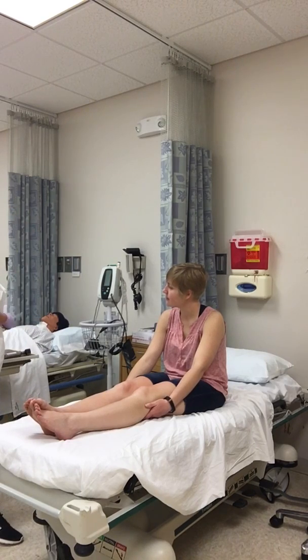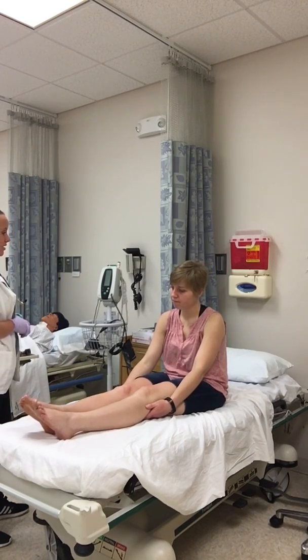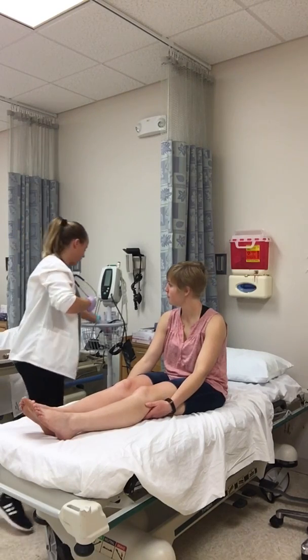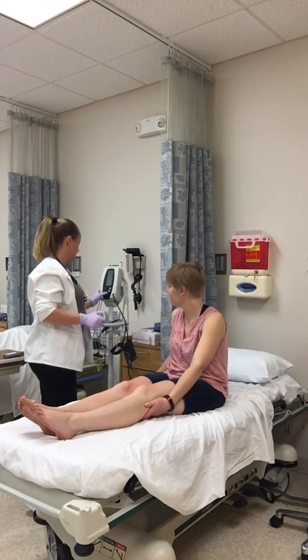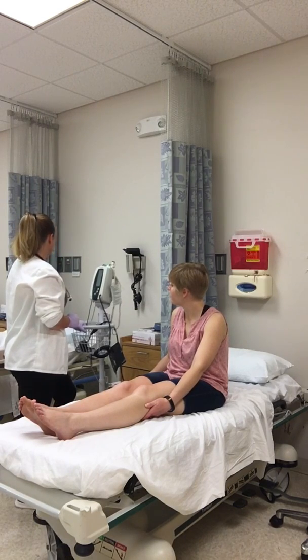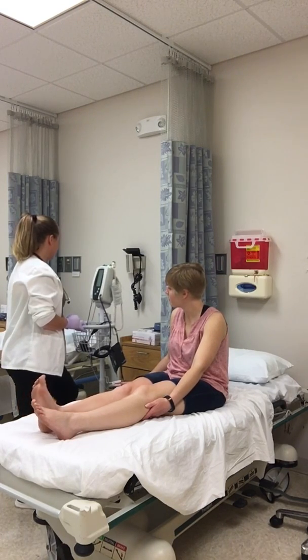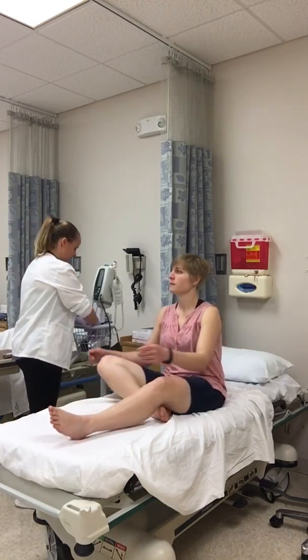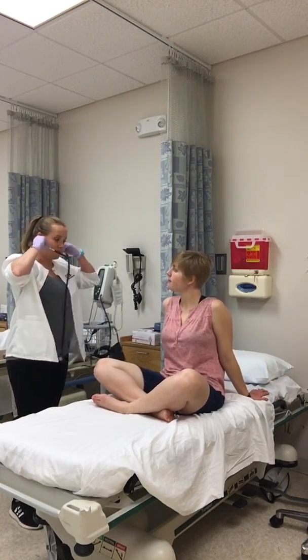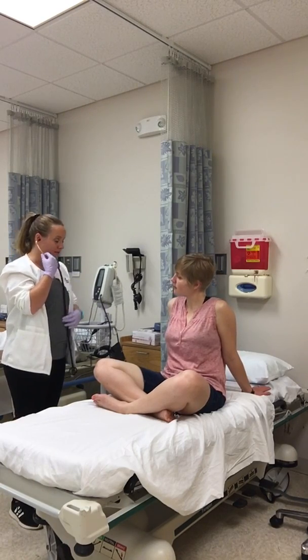The next thing I'm going to do is assess your lungs. Do you have any shortness of breath? No. Any productive or non-productive cough recently? I'm going to listen to your lungs, but let me get your pulse ox first — just checking your oxygen saturation. Your oxygen saturation is at 98%. I'm going to listen to your lungs. If you get dizzy, please let me know. I'm listening for any adventitious lung sounds, and for the depth, rate, and rhythm of your breathing.